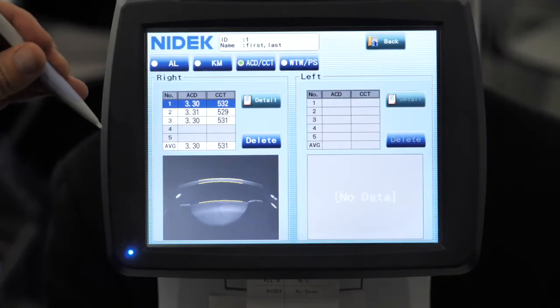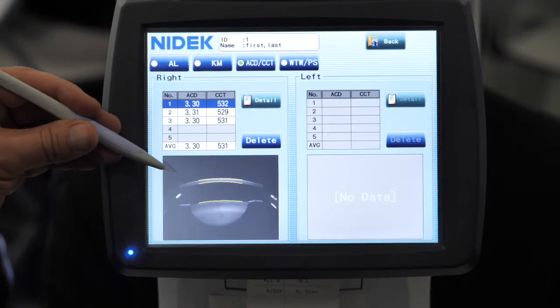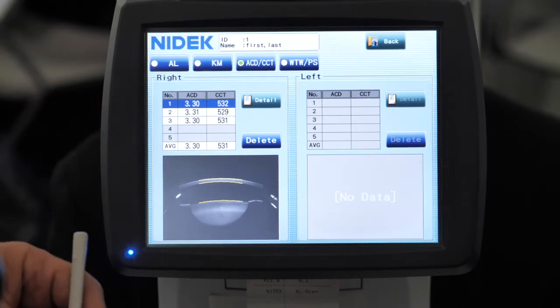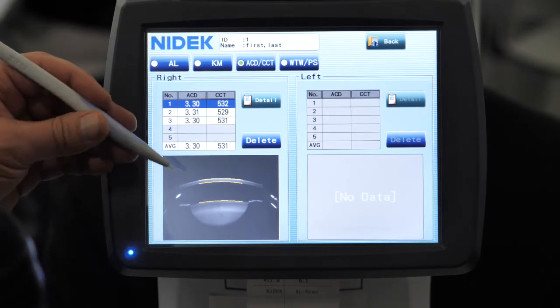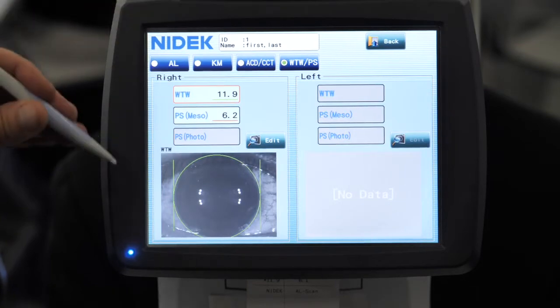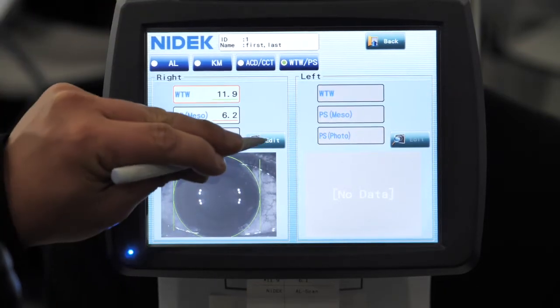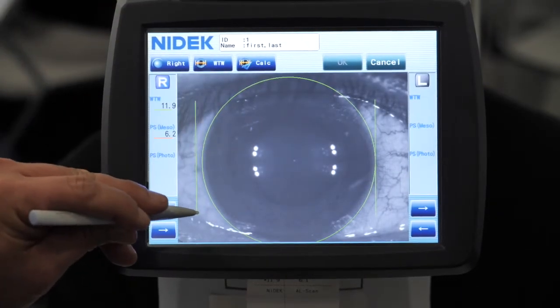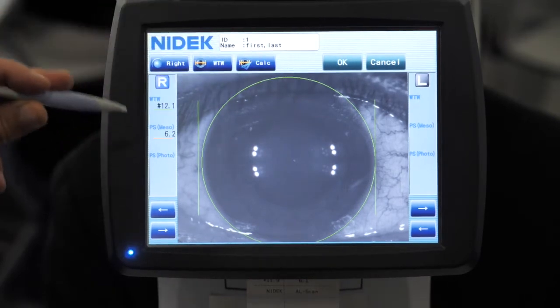For anterior chamber depth, we use Scheimpflug imaging, as you can see here. The reason we do that is because you get a more accurate anterior chamber depth measurement that way. And then for white to white and pupil size, on this screen here we can edit, we can move this out and about and recalculate if we needed to.